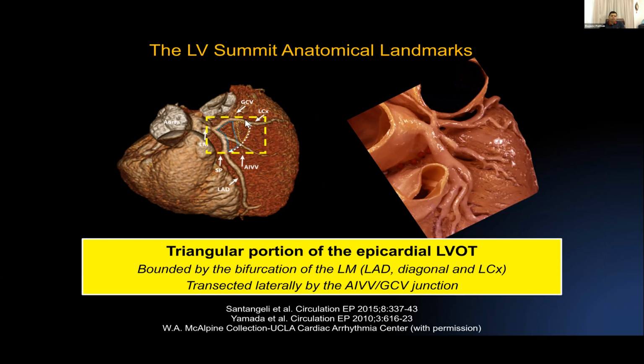And the ECG changes we were talking about: aVL being more negative in this region if the PVC is coming from here, and aVR being more negative if it's coming from this region, telling us that it's less likely we'll be able to do the ablation.